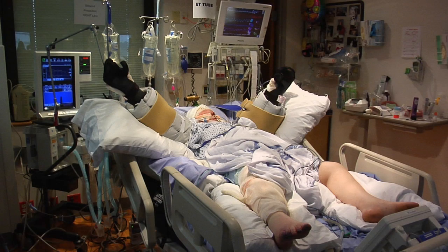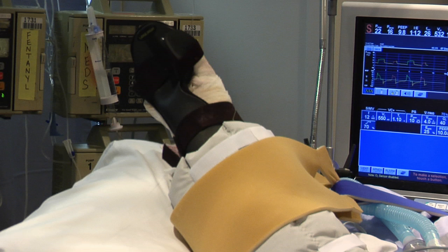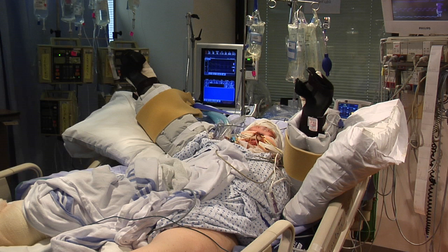Rehabilitation of the burn patient begins on admission. Maintenance of function and mobility are best accomplished by prevention. Prompt, judicious positioning of the burn part to prevent contractures around underlying joints is maintained by careful application of dressings and splints.